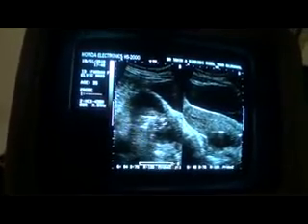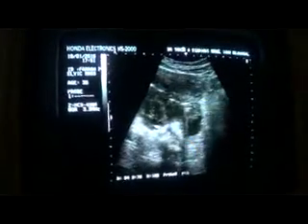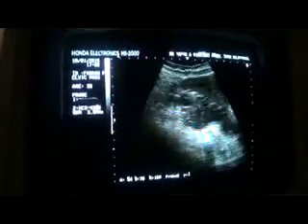Thank you very much. Well, now this is a scan after micturition, with an empty urinary bladder. I asked her to micturate. Now the urinary bladder is empty, and now she is revealing to me that she had 2 months amenorrhea, was pregnant, and went to a local LHV who inserted something into the uterus.